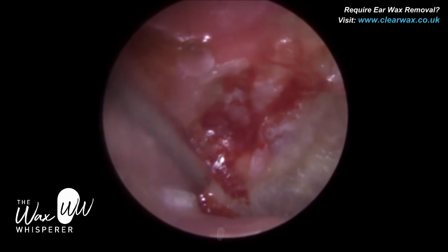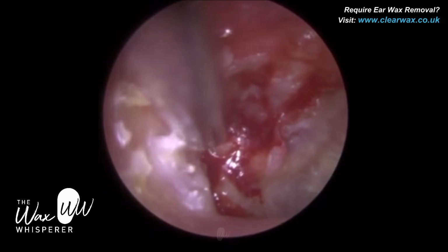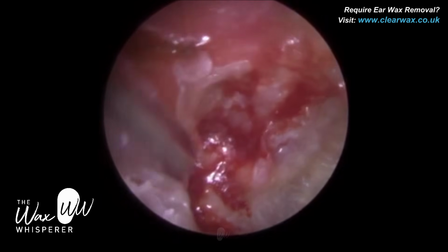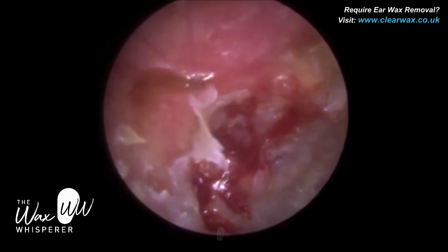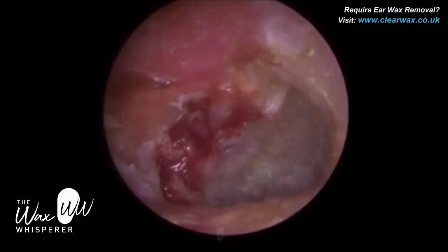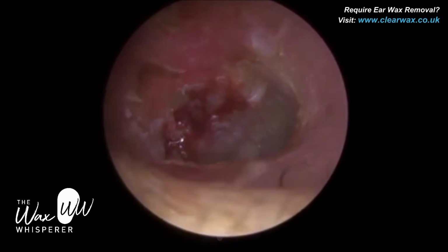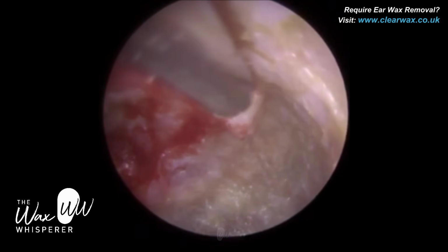So obviously this patient's been referred to ENT, and I'm just hoping that it hasn't caused any necrosis, so disease, erosion of the middle ear bones or structures. The patient did suffer from a bit of vertigo in a moment, so you'll see him move slightly, not yet, but a bit further on. And what I'm trying to do here now, awaiting ENT is a long time because of the pandemic, so I could have advised the patient, if possible, if they can go private, it would be better for them. But I'm just trying to remove as much dead skin as possible.